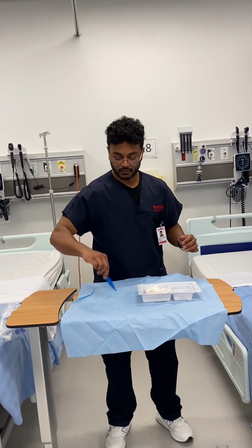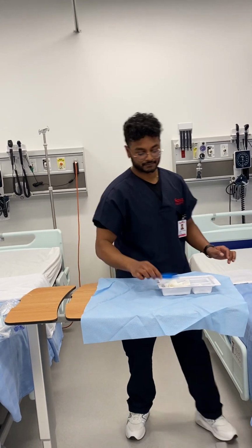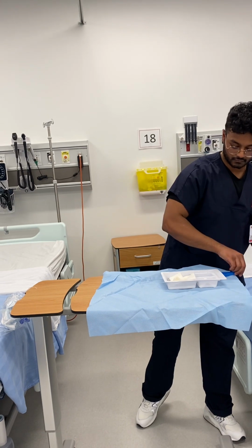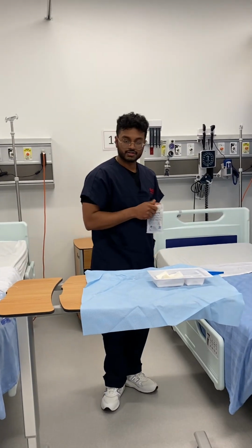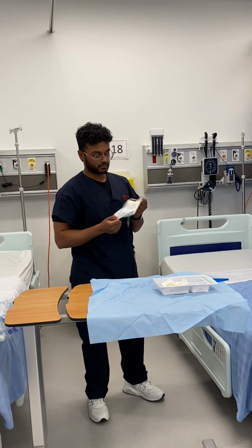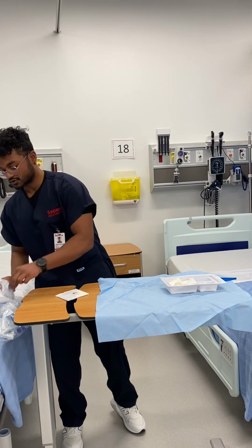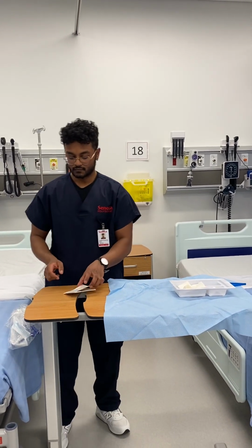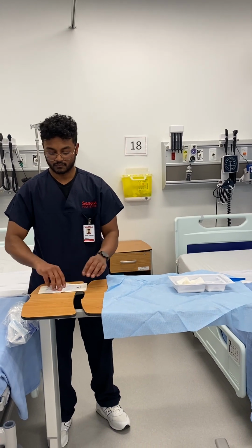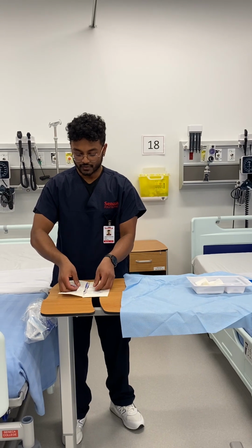Raise the bed rail, making sure to leave some space. I'm going to raise the bed rail on the next side. Moving our sterile gloves away from our field. Placing it down. Throwing this in the trash. Opening up our gloves, making sure not to interfere with sterility. Opening from the sides.